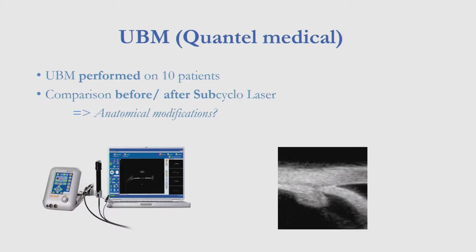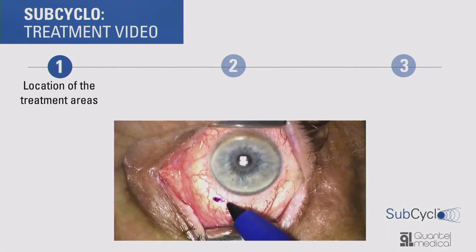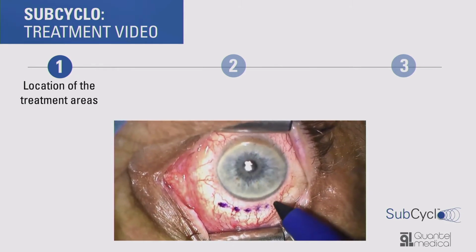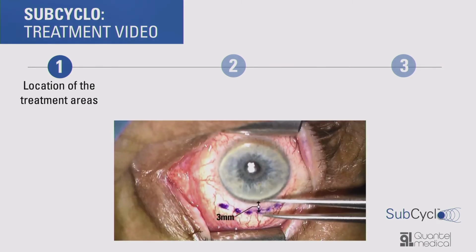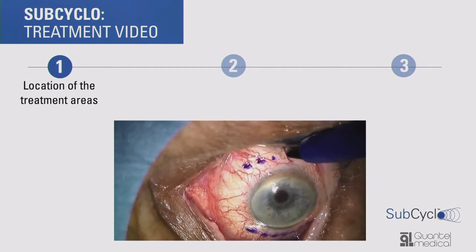This movie shows the procedure. Here is the location, 3 millimeters from the limbus, in the superior and inferior areas.